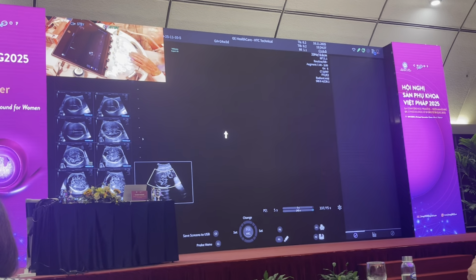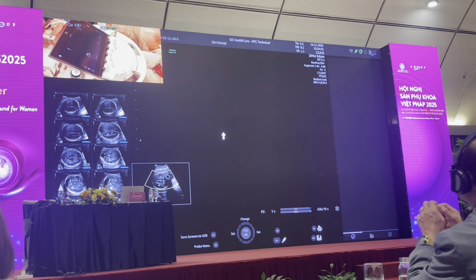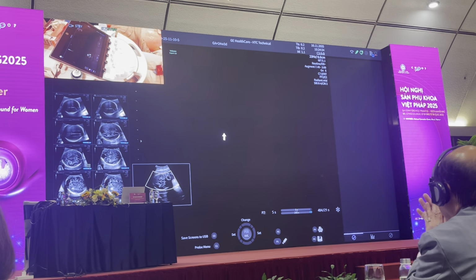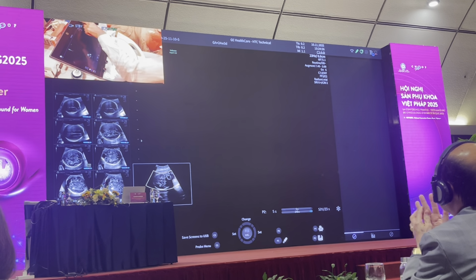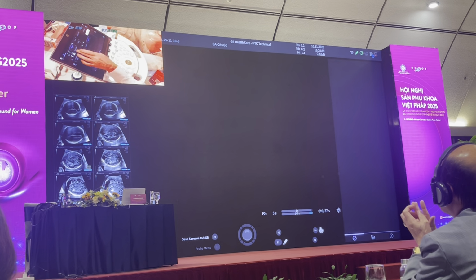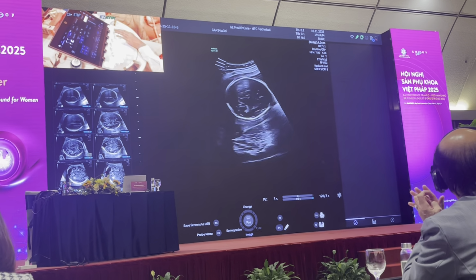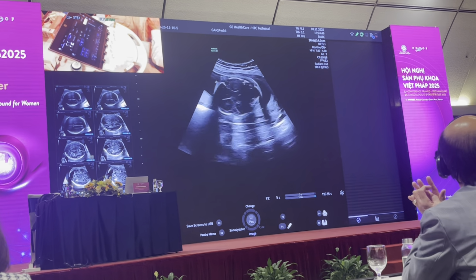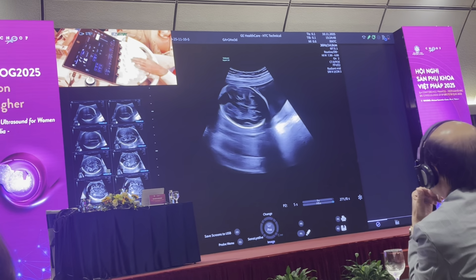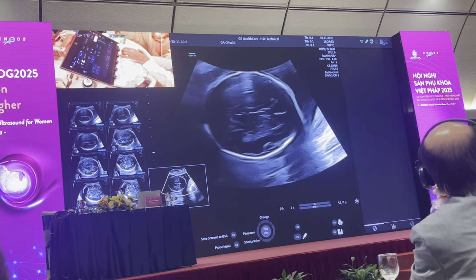I'm going to move back to the other probe to see both, because I think I'm going to get better resolution. You will note that every time I do a scan, I never scan with one probe. I always move between probes, because I believe that you can only find out what probe is best if you move between two probes. If you just set up the one, you don't know if you have best resolution. Now let me come back and have a look at the sutures again. I'll just come back and have a look at that Sylvian.